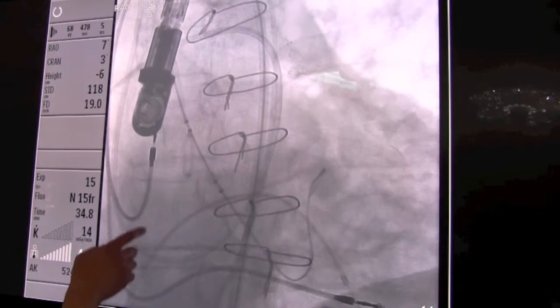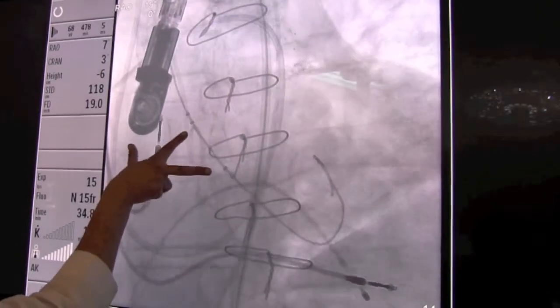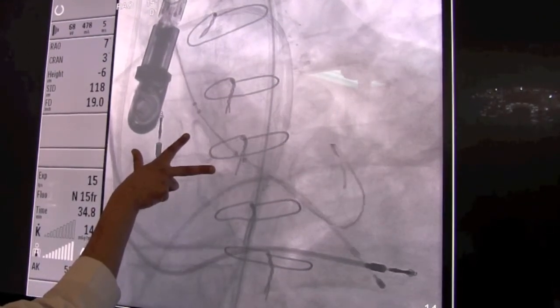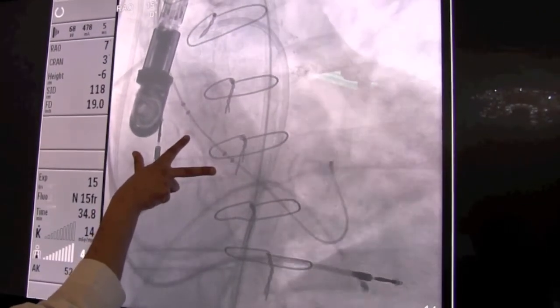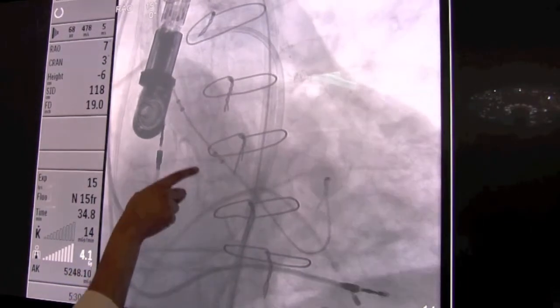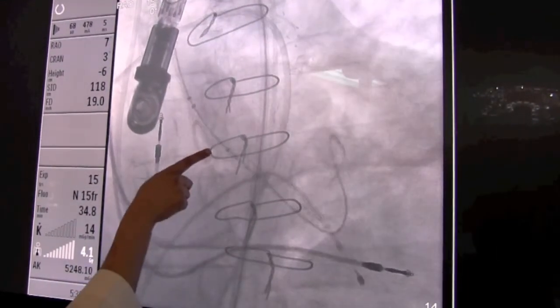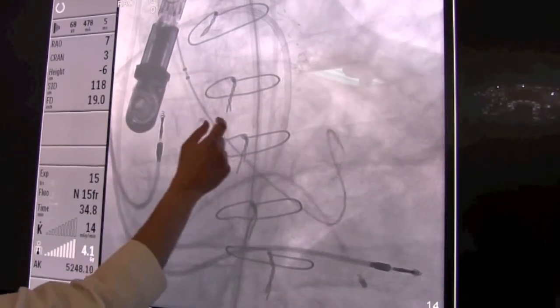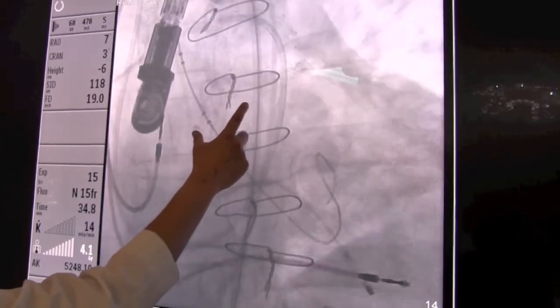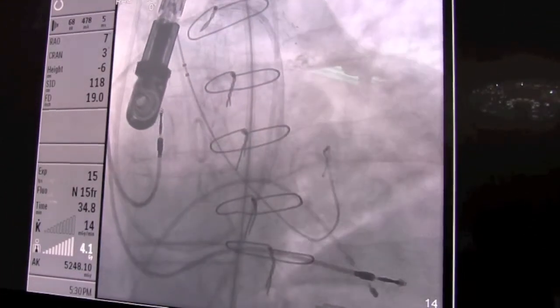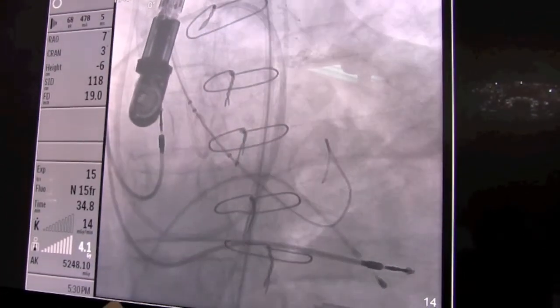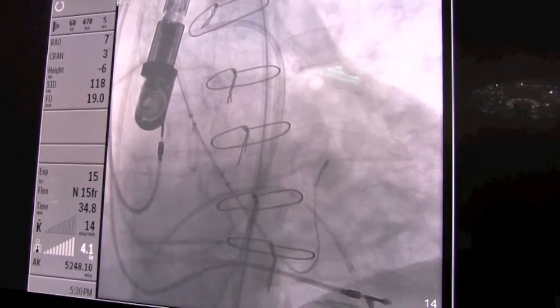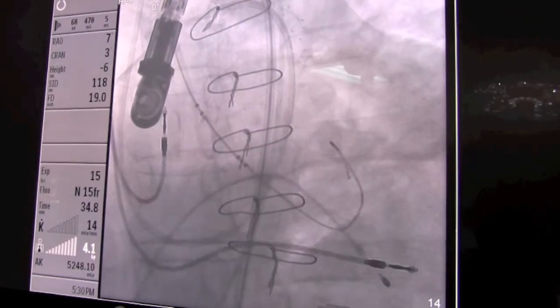Here we're doing the balloon valvuloplasty. This is the valvuloplasty catheter — it's essentially a balloon — and we inflate it while we're pacing the patient's heart rapidly so that the heart doesn't kick out the balloon. We open up that valve a little bit to make some room for the new valve.